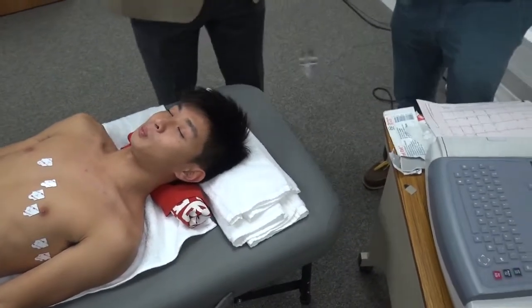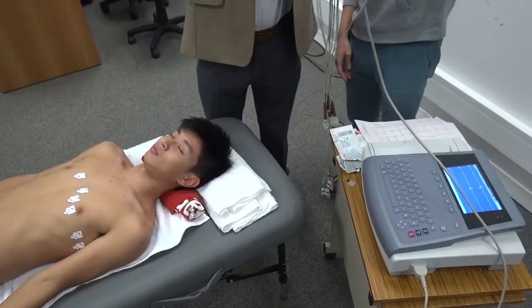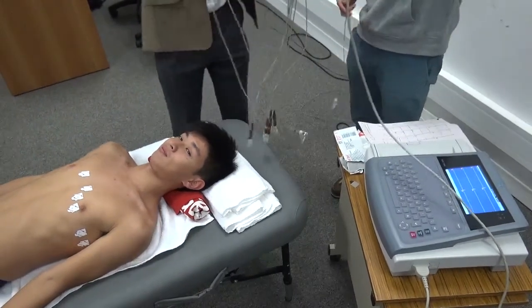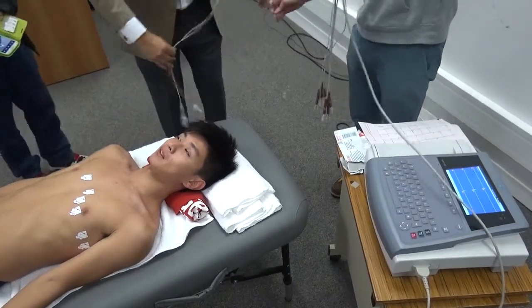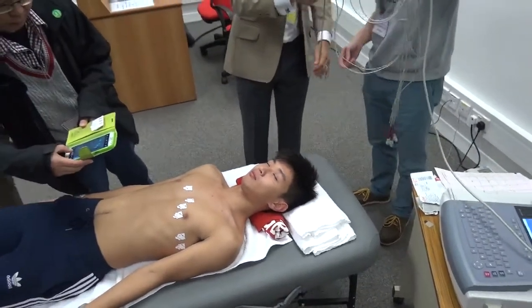Here you are. That's okay. What you do then is you go to the top end, and you know that the limb leads are on the sides. So I do this bit first. You take the limb leads here. You go to the end, and you have a look. This is left, this is right.